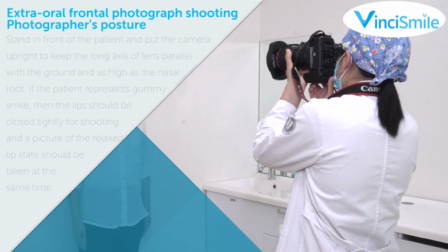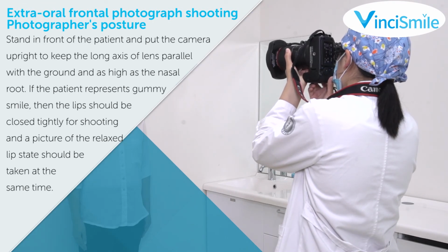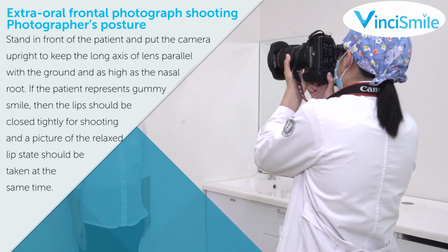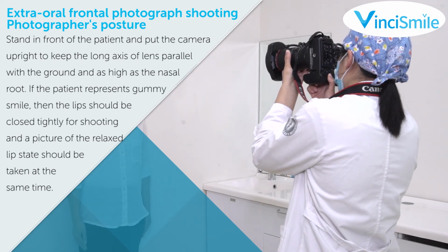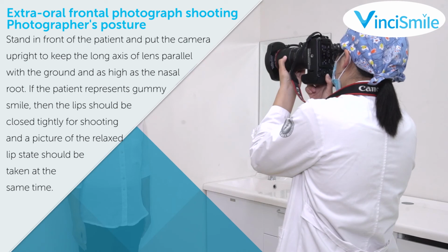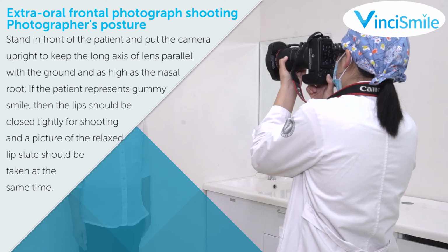Extra-oral frontal photograph shooting. Photographer's posture. Stand in front of the patient and put the camera upright to keep the long axis of lens parallel with the ground and as high as nasal root. If the patient presents gummy smile, then the lips should be closed tightly for shooting, and a picture of the relaxed lip state should be taken at the same time.